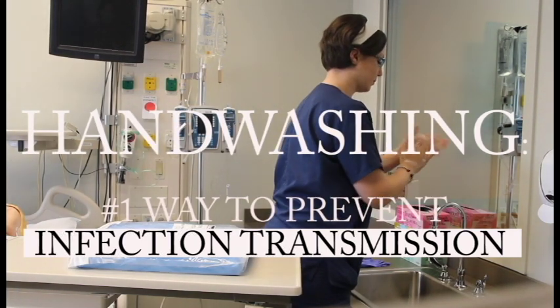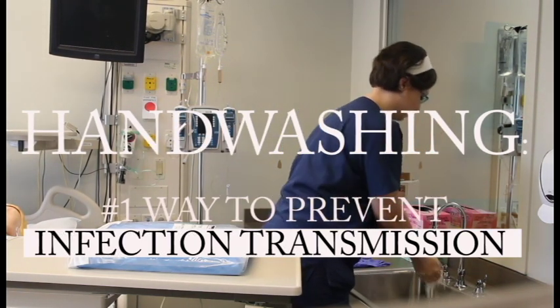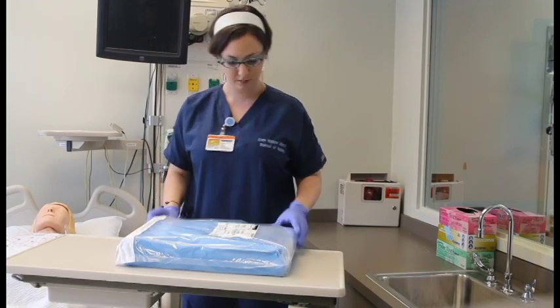Remember that this is a self-contained sterile unit. Aseptic technique should be followed during the setup of a CDU. Glove up. Open your package and lay out the contents.